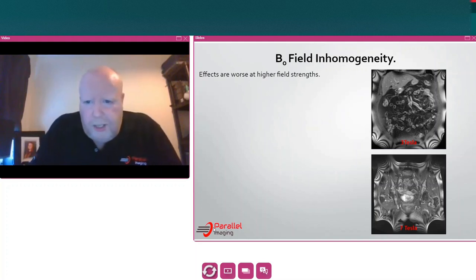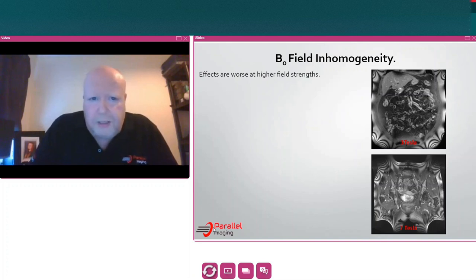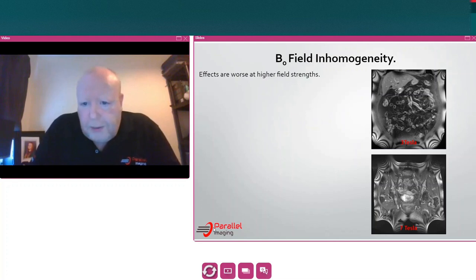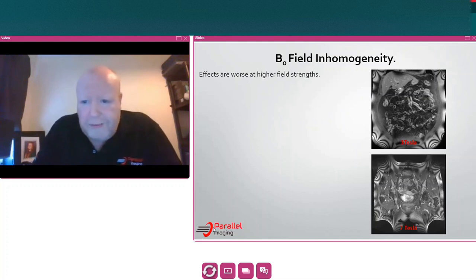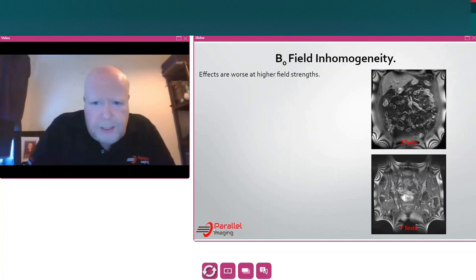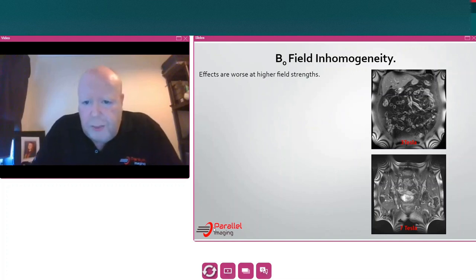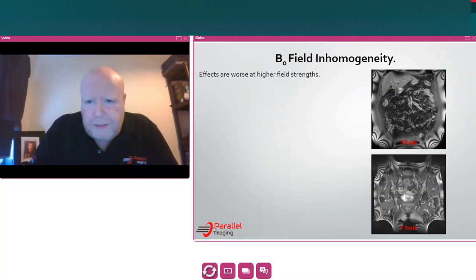Just a note of interest: these effects are much worse at higher field strengths. For those who've had the opportunity to work on a 7 Tesla scanner, the banding artefacts are much, much greater at 7 Tesla than at 3 Tesla.